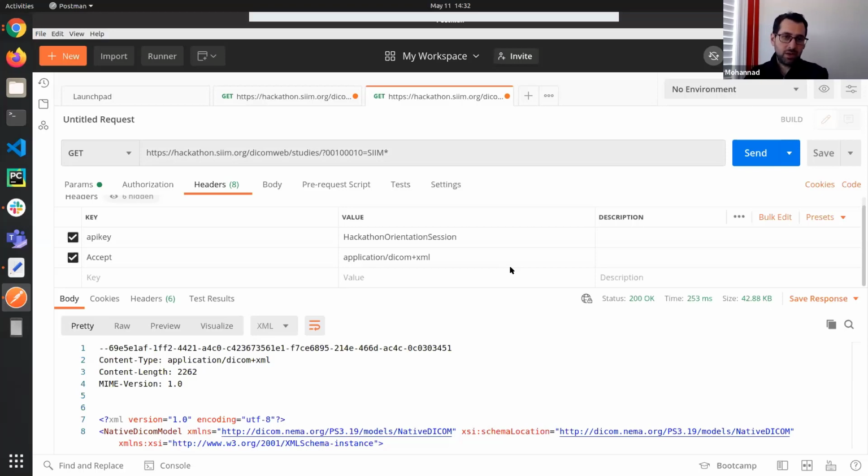The difference I wanted to highlight, though, between JSON and XML that is important to note is this chunk right here. And this is actually the reason why the syntax highlighting doesn't work right away. This is what is in HTTP lingo called a multipart response. I'm not going to spend a lot of time talking about what it is and how it works, but I'm going to summarize it with two anecdotes.